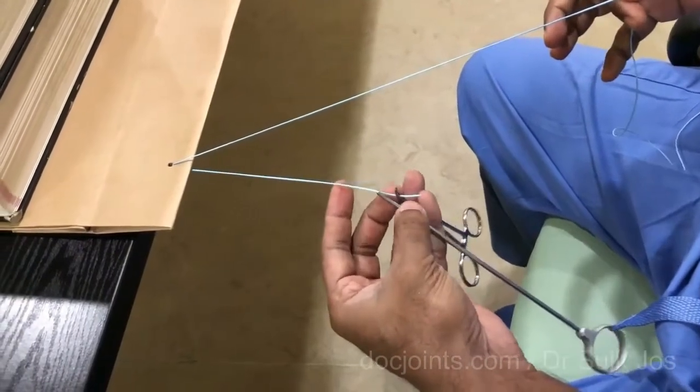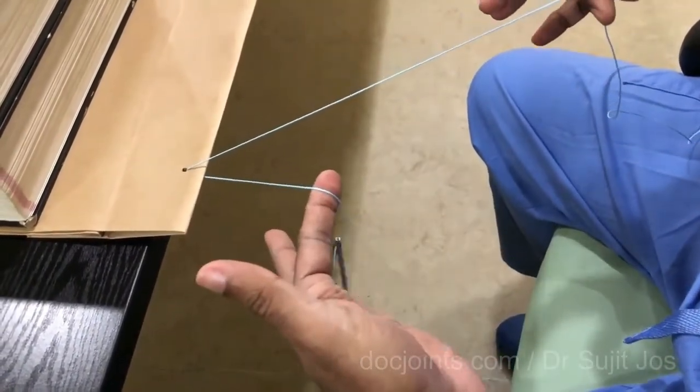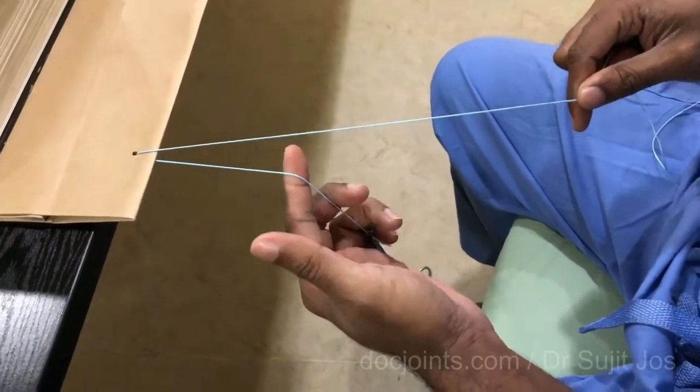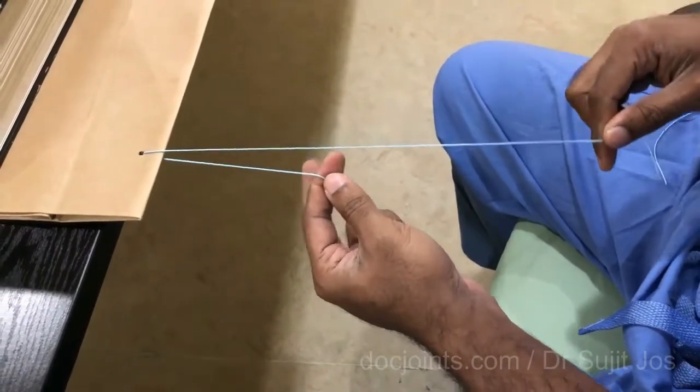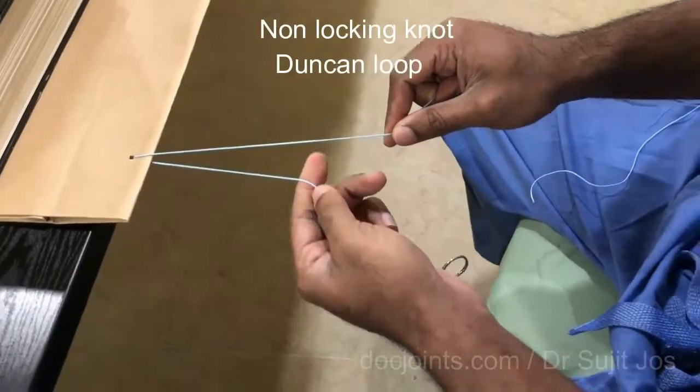We let this hang down. There are two types of knots: the locking and non-locking. First I will demonstrate the non-locking knot, which is the hangman's noose or the Duncan loop.